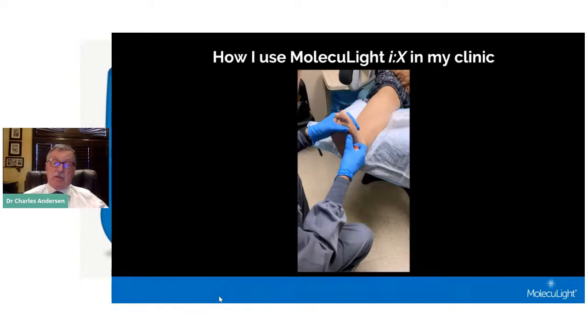Today in clinic, a very good example, we had planned on using a fairly expensive biologic tissue. We scanned the patient. Not only was there significant bacterial burden within the wound, but just like the case that I demonstrated a few minutes ago, there was significant bacteria in the tissue around that wound. So we aborted the use of that biologic tissue. That patient we debrided, and we also placed on systemic antibiotics. We also changed the follow-up plan. He's being treated for a chronic venous leg ulcer, but knowing that there's significant bacterial burden, we're going to bring that patient back after a shorter duration to change that compression wrap.